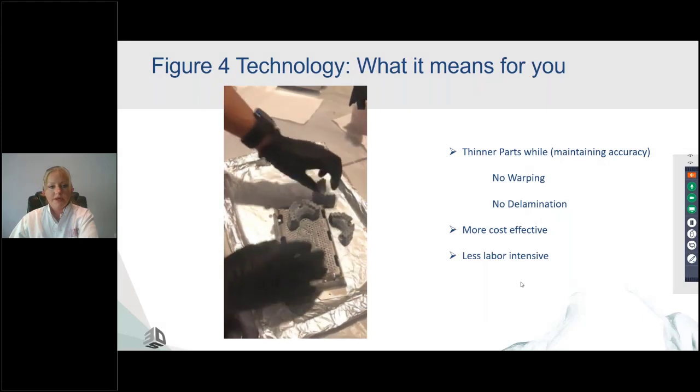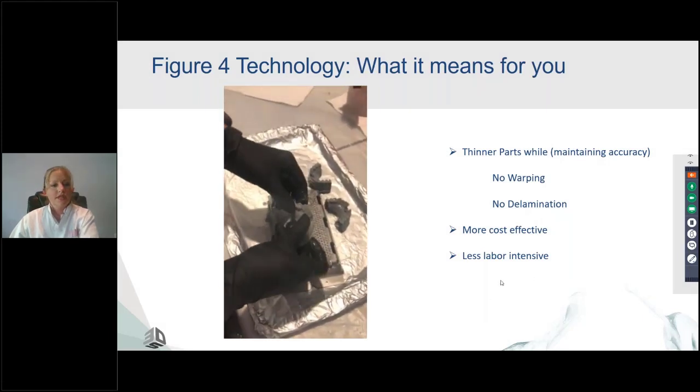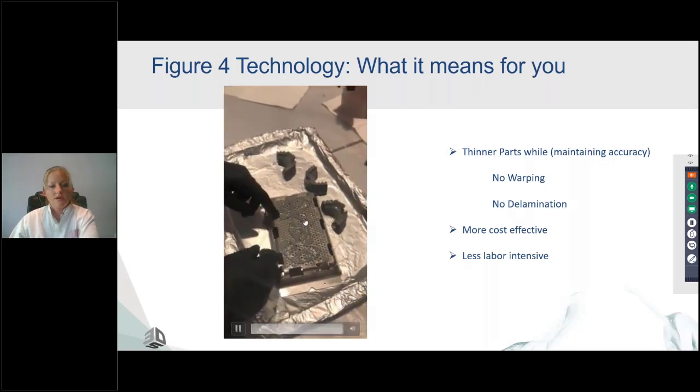And this is with every type of part. Okay, and then you'll clean them. And you'll punch your tray, and it takes about, I would say, I put my parts into my IPA, and in about a minute and a half, my tray is clean and back in the printer. So a minute and a half, not too bad, with little or no scarring.